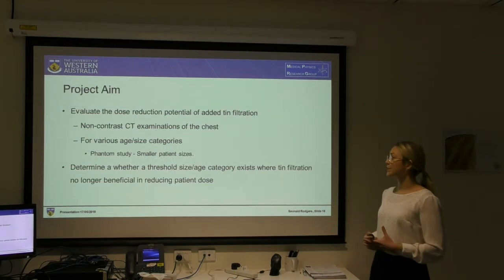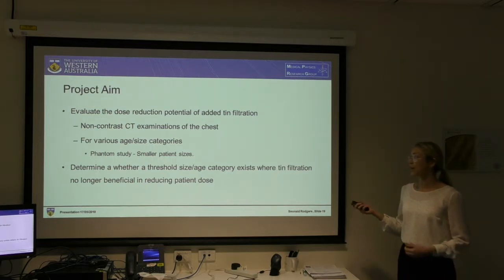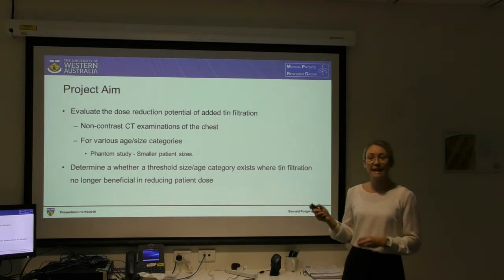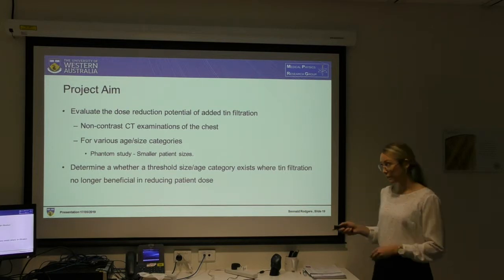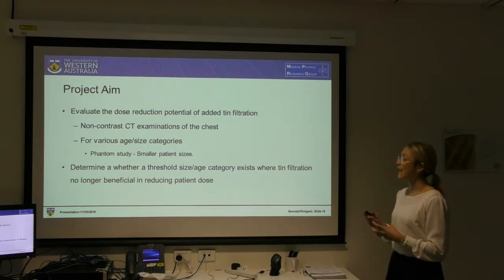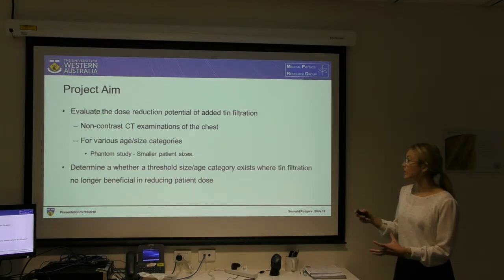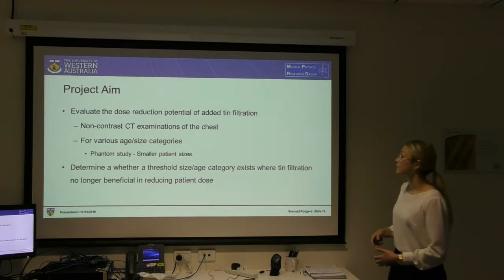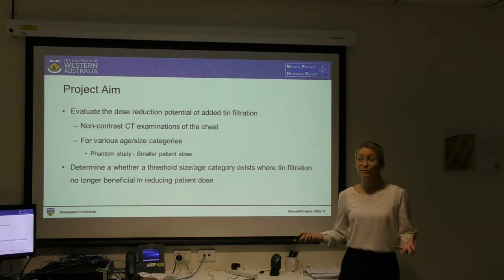So, the aim of my project is to evaluate the dose reduction potential for added tin filtration for non-contrast CT examinations of the chest for various age and size categories, with a special focus on smaller size categories. A secondary aim of my project will be to determine whether there is a threshold size or age category below which tin filtration is no longer beneficial in reducing the dose, and hopefully propose an alternative method that is more dose efficient.